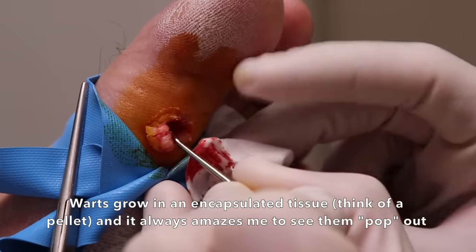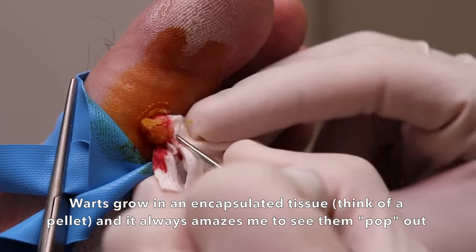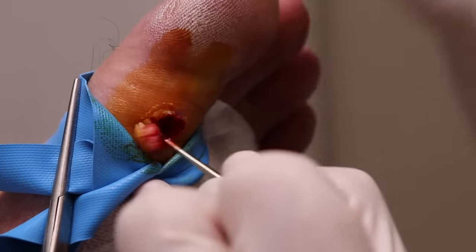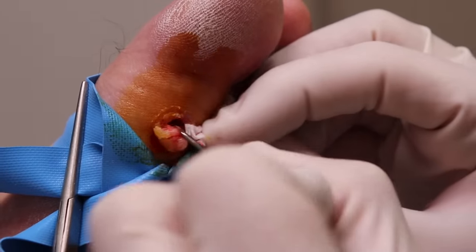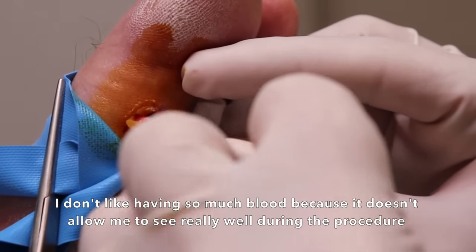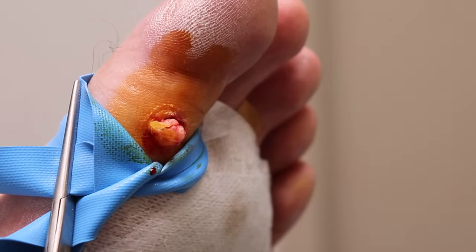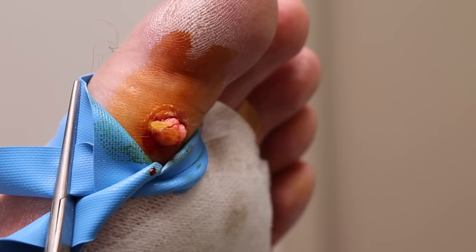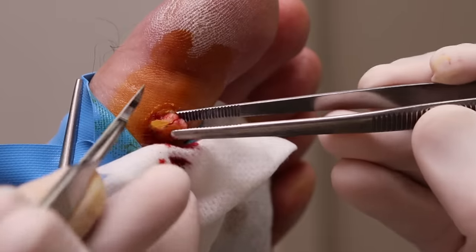Will it damage the structure of the toe? No, it's going to look okay. Warts don't live deeper than the top layer of skin. The skin will heal up like normal — it'll look nice and flat afterwards, and the skin will fill in right behind it. It's a big wart, and it always surprises me how no matter how much acid or other things we try, it just won't come out — it's just too thick. That's why surgery is a great option for certain warts.